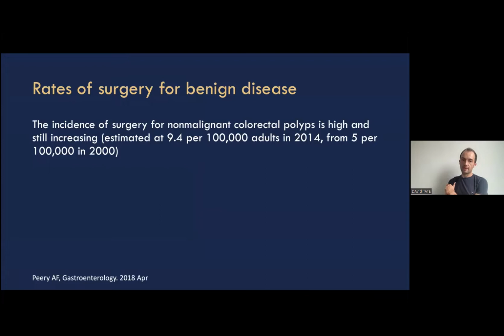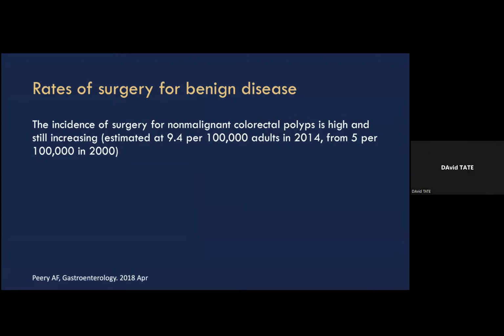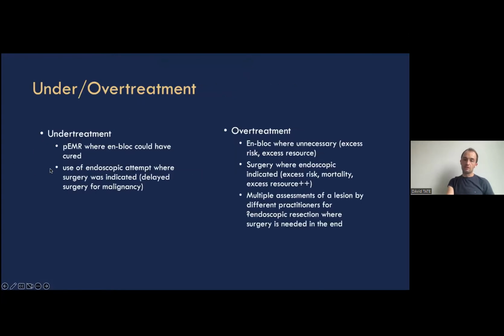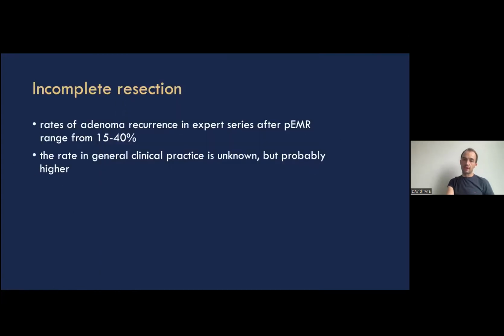We have some evidence, this is one particular example, to suggest that a lot of surgery has been done for benign polyps, and we would argue that that comes down to imaging of polyps. And we might suggest, in this nice article from Roland Valori, that post-colonoscopy colorectal cancer, the thing we must avoid when doing polypectomy and colonoscopy, certainly some of it can be attributed to doing polypectomy badly.